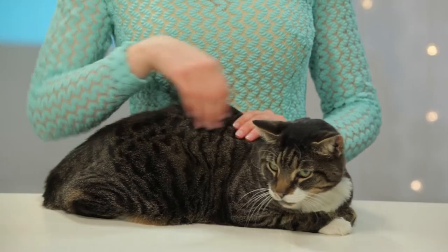Instead of doing it the hard way, say hello to Lucy. Meow Meow is a domestic short hair cat. Meow Meow and Lucy are going to show you how to use the Twisted Dose applicator. Let's get started.